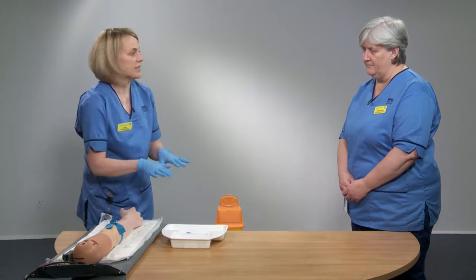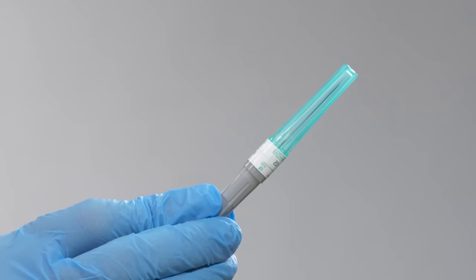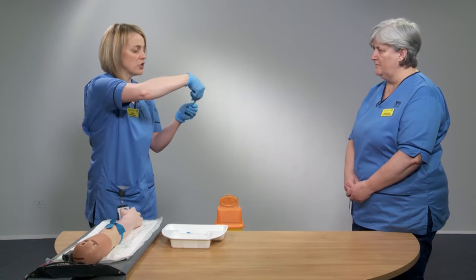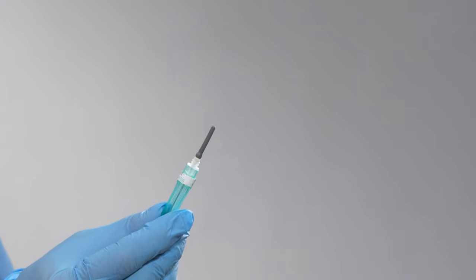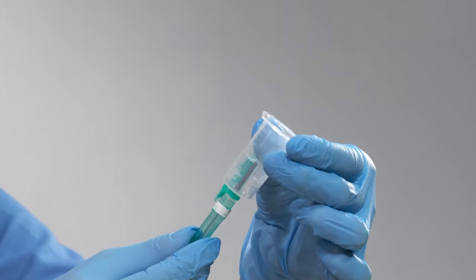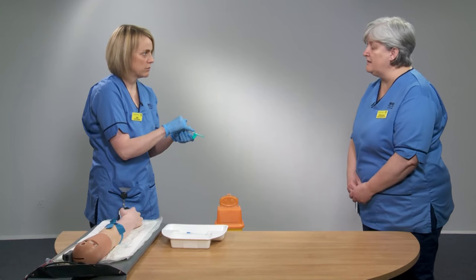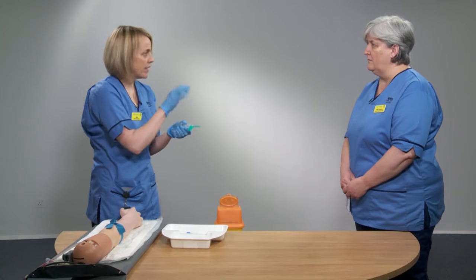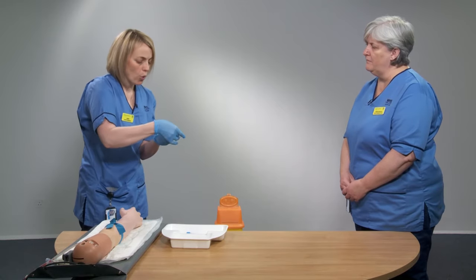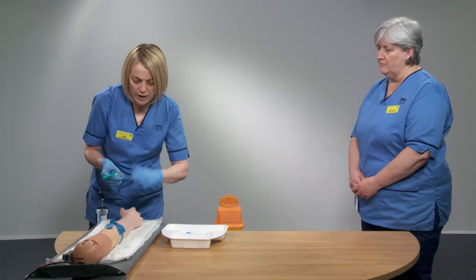While the skin is drying, assemble the quick shield equipment. The quick shield needle has a grey cap on the end — unscrew that cap and attach the needle to the quick shield device using a non-touch technique, screwing it on until secure. On the top of the cap there is a black dot — when you unsheathe the needle, this indicates the needle is pointing the right way, with the beveled edge facing the ceiling.